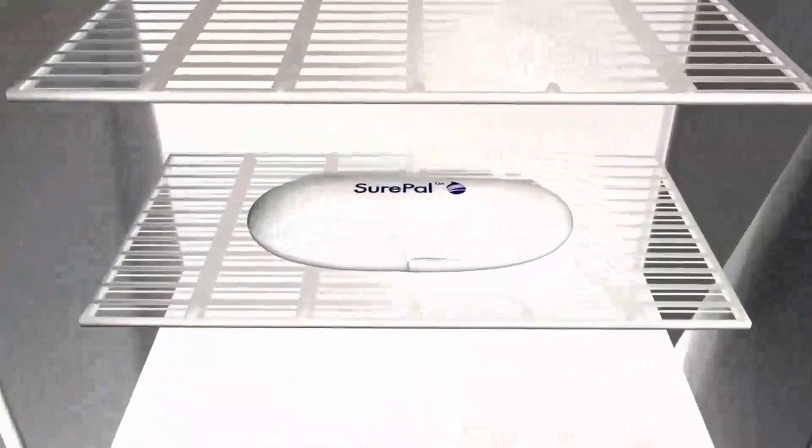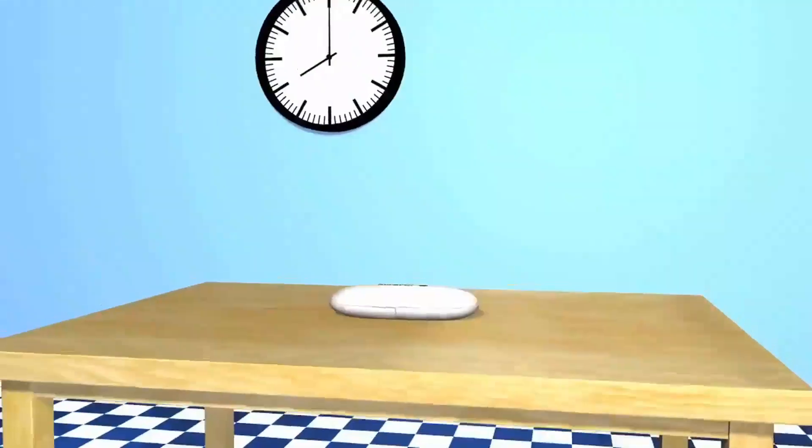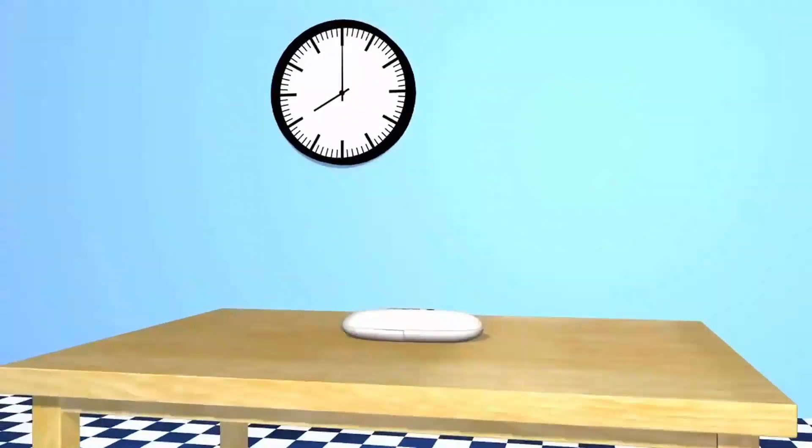Wash your hands, then take your SurePal out of the refrigerator, where it should be stored inside its hard case. It's recommended that you take the cartridge out of the refrigerator for no more than 30 minutes before your injection, and put it back right after you inject.